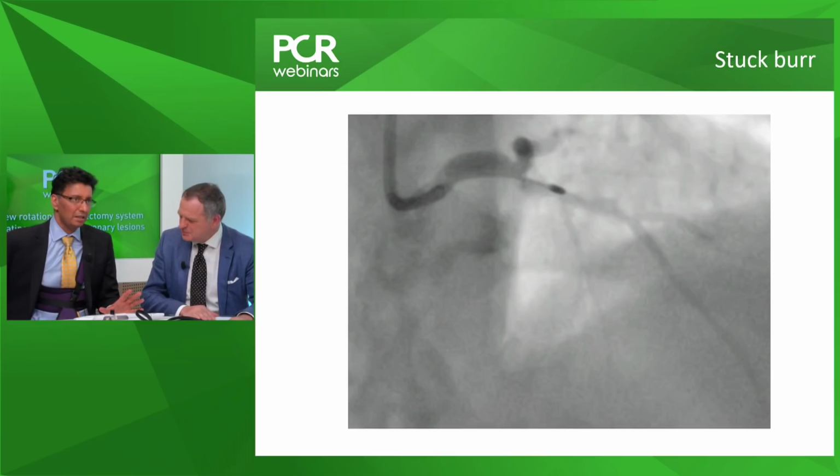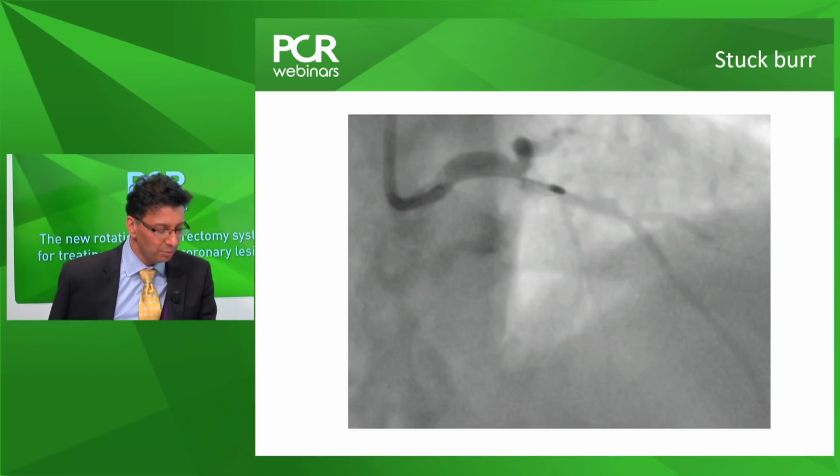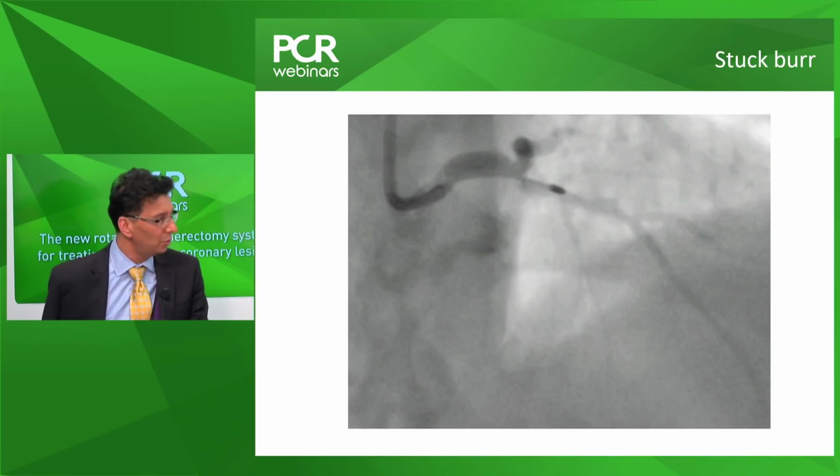Perhaps Sagar, do you have any thoughts about some of the cases you may have seen, perhaps not through personal use, but some of your experience? So just coming back to Bruno's point, absolutely. I think it's 9 times out of 10 actually due to operator error, and it's usually just, in my opinion, too aggressive pushing forwards.